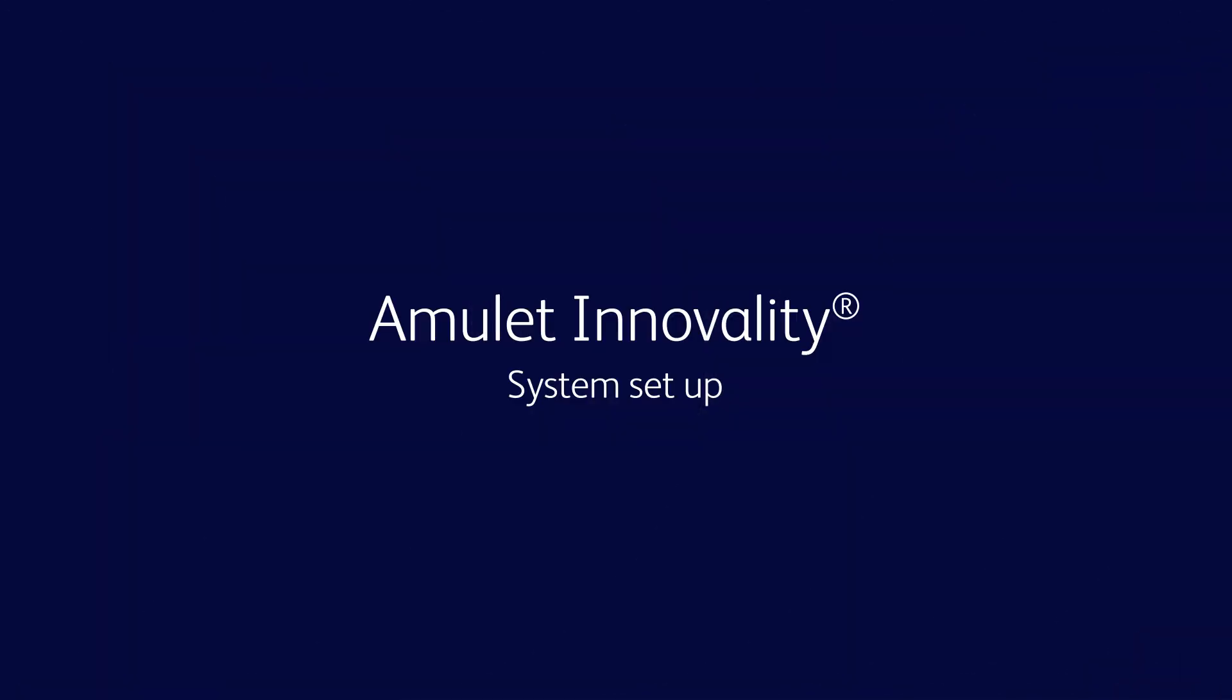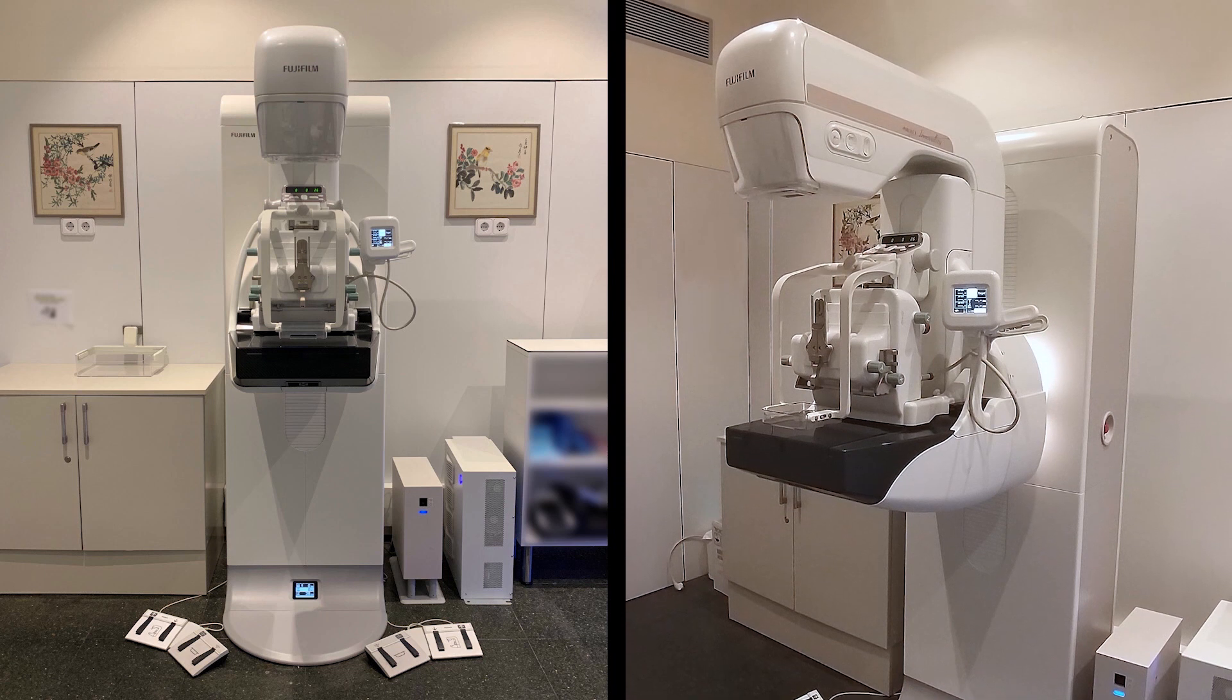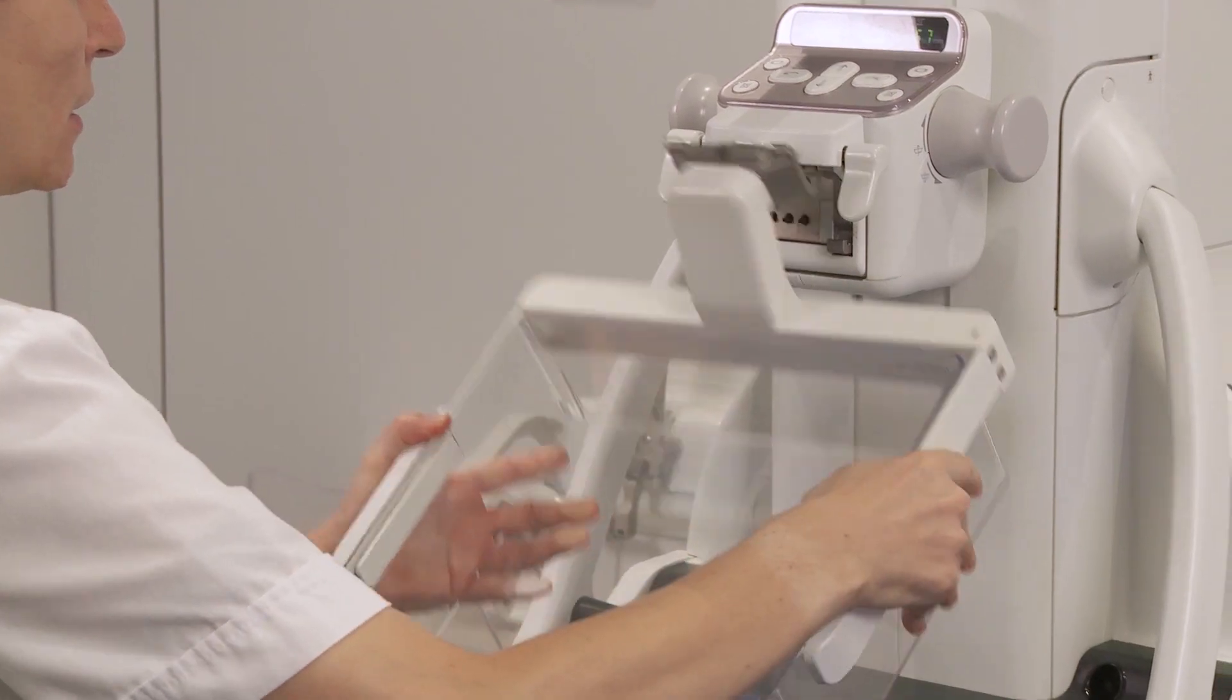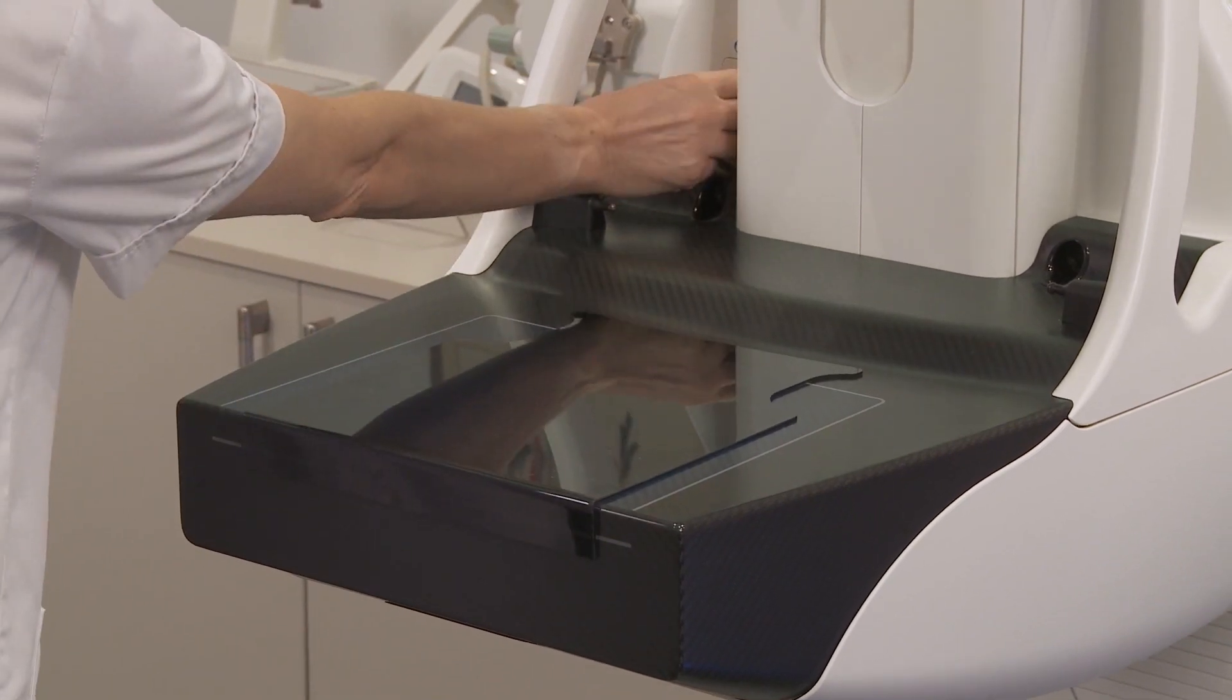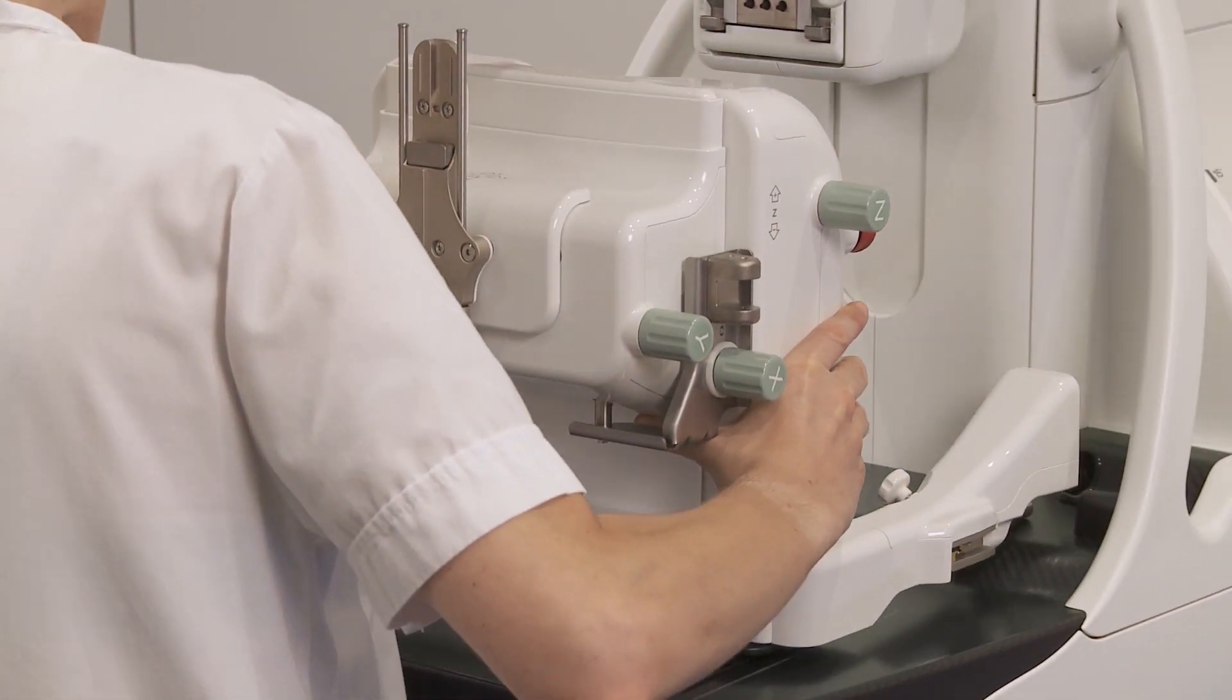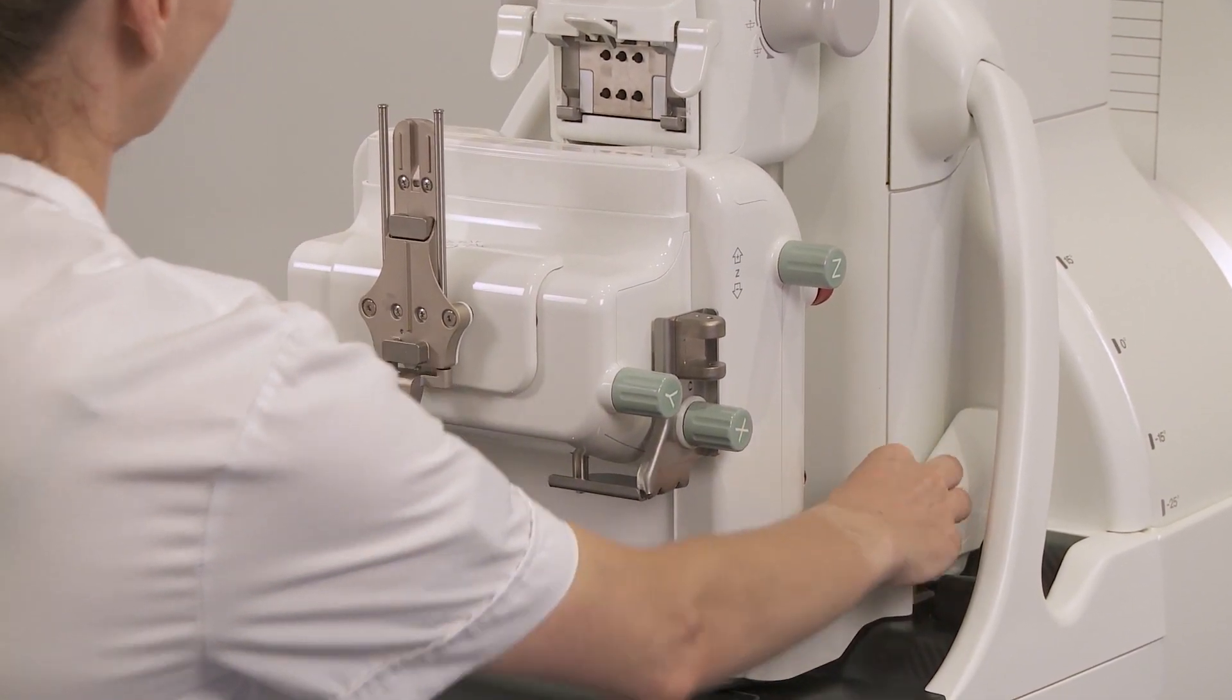Get Fuji Amulet Innovality ready for biopsy exams. Steps to follow: Remove universal face shield, remove compressor paddle, place the protective sheet over the breast support, open the cover of the biopsy positioner connectors. The compressor paddle assembly position should be high enough for biopsy positioner insertion. Insert the biopsy positioner carefully into the dedicated holes in the gantry column and ensure the red section on the locks is not visible.